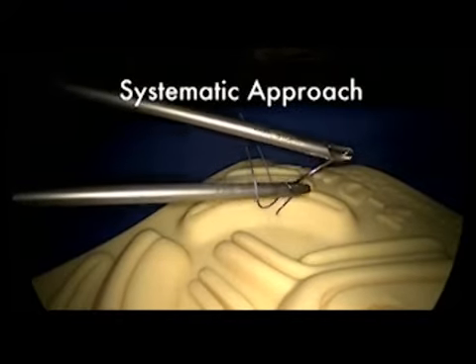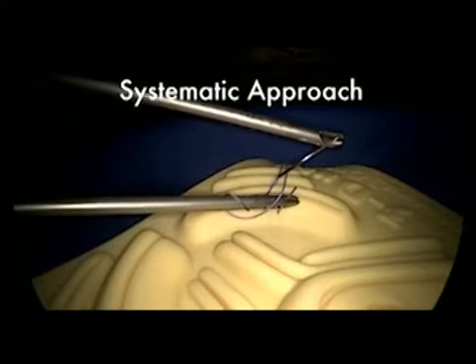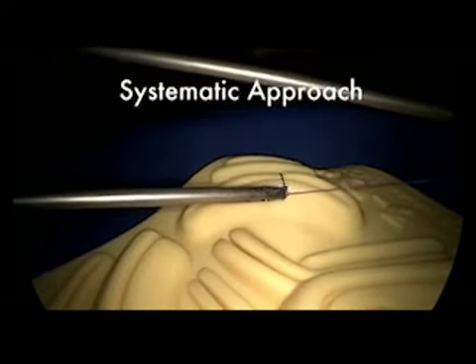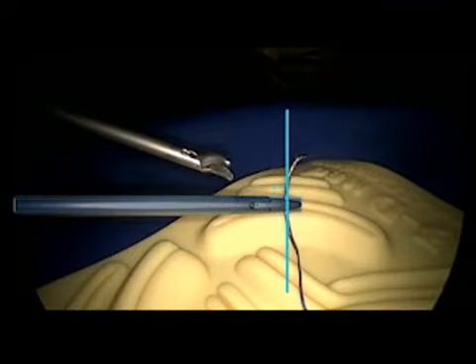efficiency. We have divided laparoscopic suturing into three main sections to help aid in conceptualization and for training purposes, which are setting of the needle, tissue reapproximation, and knot tying. The goal is to set the needle in a plane that is perpendicular to the rotational axis and shaft of the needle driver.